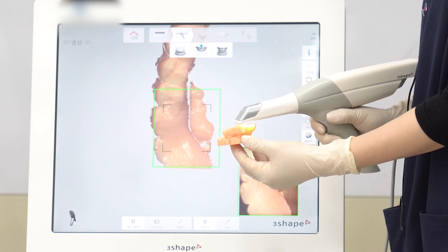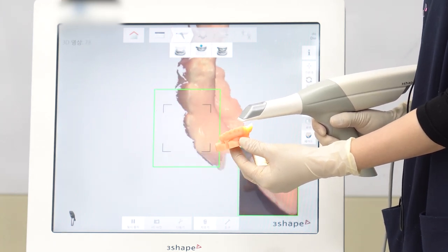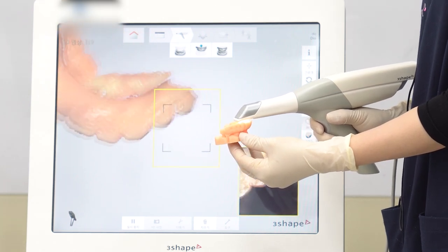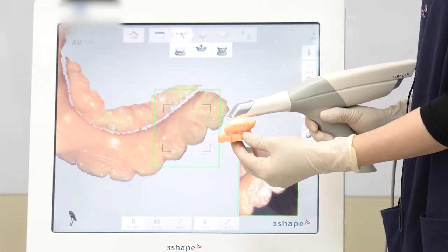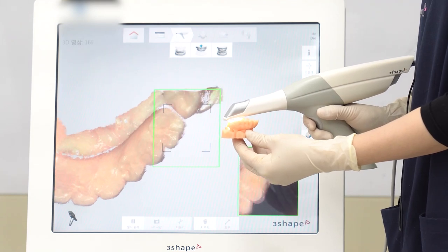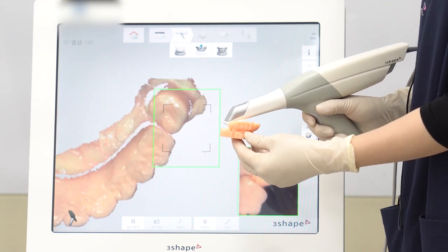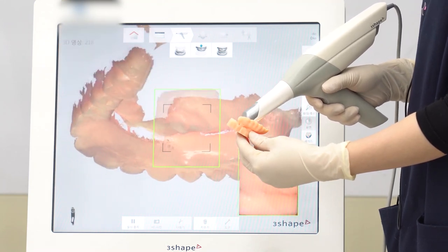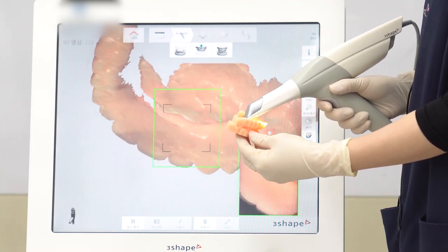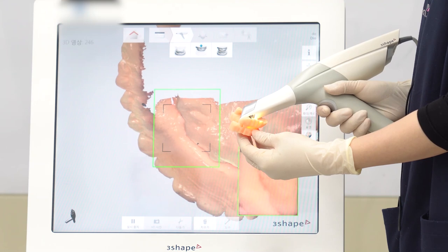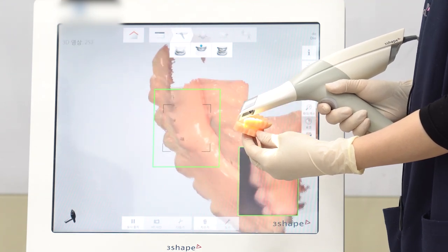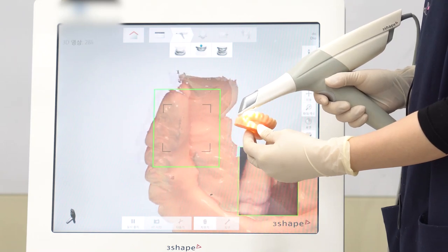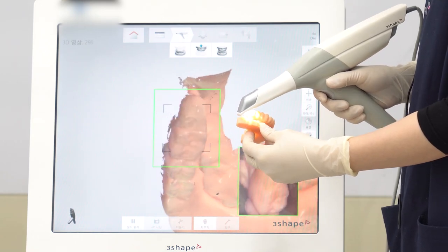While scanning, make sure the screen shows a green box, which means it is scanning well. Slide over to the palatal area and keep scanning. Next, slide to the buccal area.